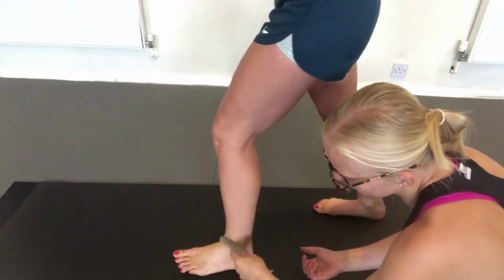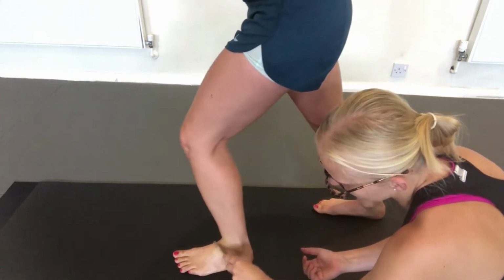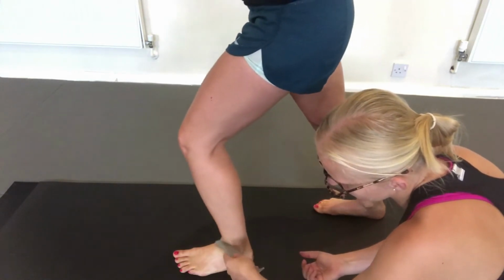And into a standing position from here, so you can work on the front foot, working into dorsi and plantar flexion, so working into the dorsum of the foot and the anterior ankle.